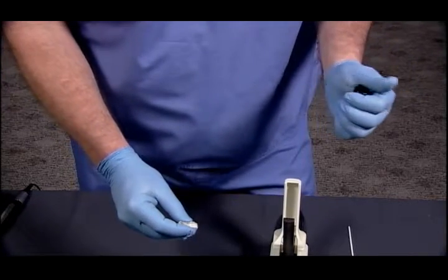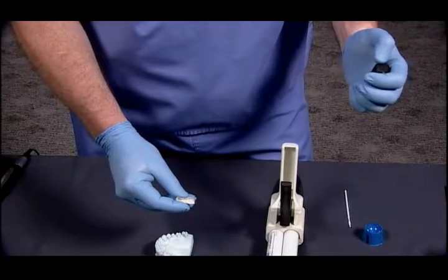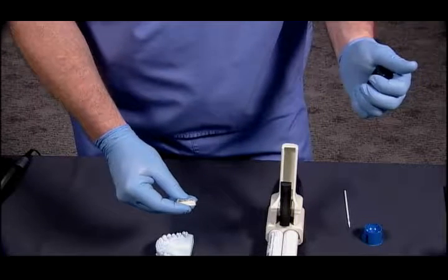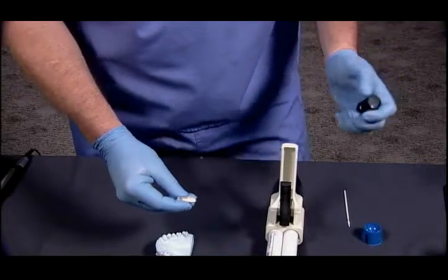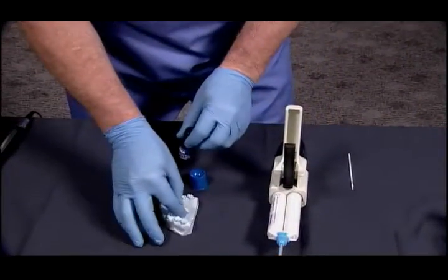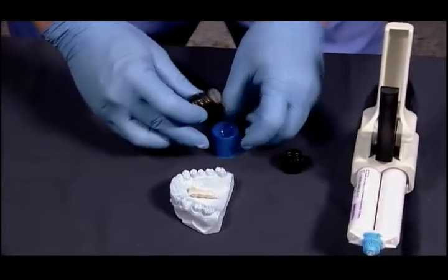And what you have to do in order to get the Bis Acryl material to stick to the polycarbonate shell is to use a Bis Acryl varnish. Two materials that we know work very well with this are the Sultan material and the Stern Gold Bis Acryl varnishes. So we're going to put a small amount of the Bis Acryl varnish inside of this polycarbonate shell. And I'm going to put just a dot down there.